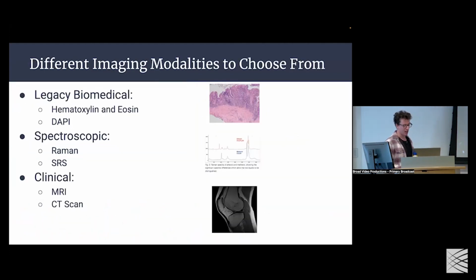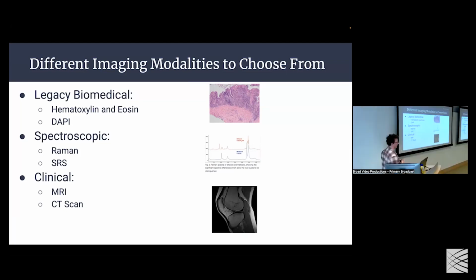And with that being said, this sets the stage for, okay, we'd like to go from images to omics. We have this very broad goal. And we have to think, what kind of images should we work with? Again, as I said before, there are pretty much these three families that we're interested in. Legacy biomedical, things like H&E, things like DAPI; spectroscopic, Raman, that's fancy stuff, SRS, that's fancy, PIR, that's fancy; and clinical data, which again is a real wish list type thing because that's probably the hardest to learn from, but it's a nice thing to keep in mind.